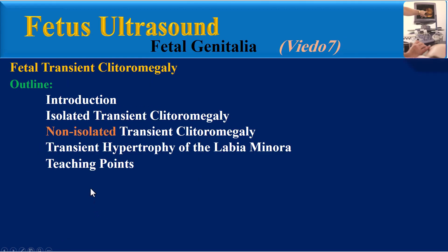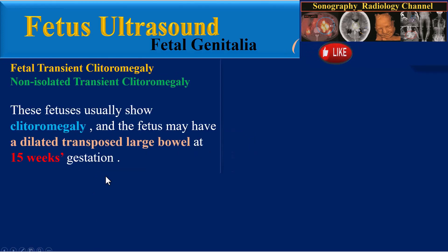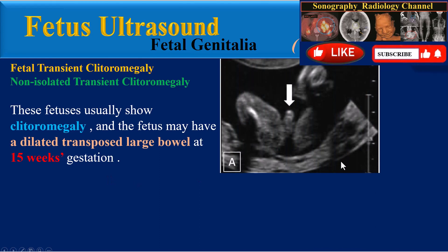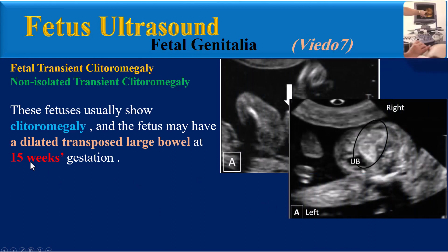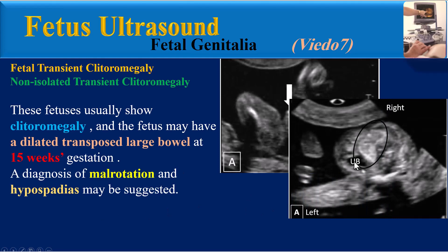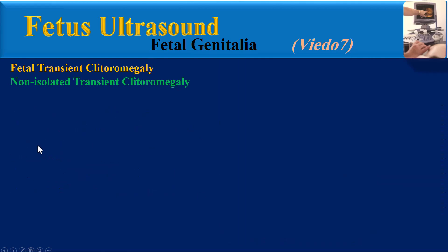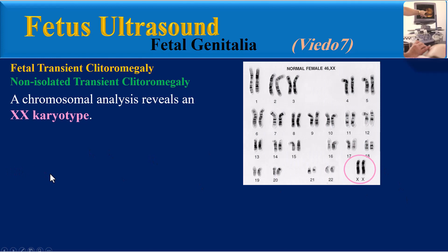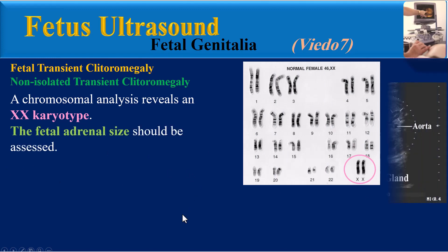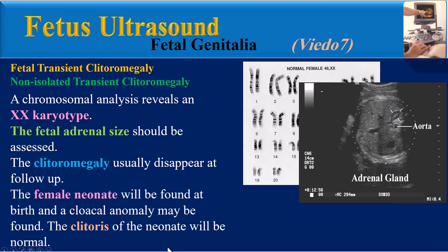This image from the same fetus at 22 weeks gestation, in a coronal plane, shows normal appearing female external genitalia with a normal clitoris. All these fetuses have normal genitalia after delivery. Regarding non-isolated transient clitoromegaly, these fetuses usually show clitoromegaly, and the fetus may have a dilated transposed large bowel. At 15 weeks gestation, a diagnosis of malrotation and hypospadias may be suggested. Chromosomal analysis reveals an XX karyotype.